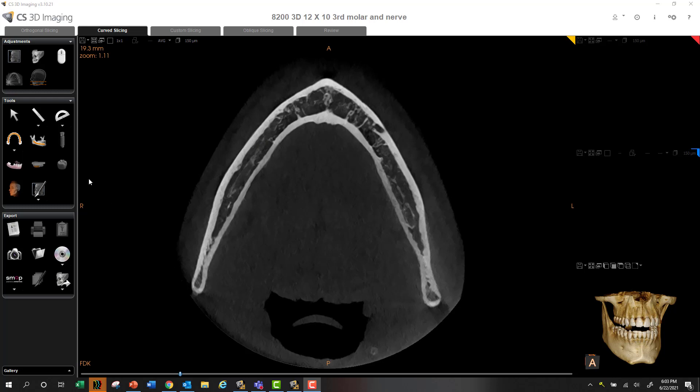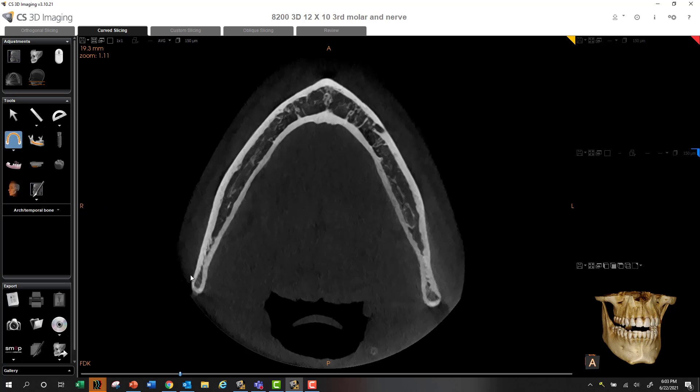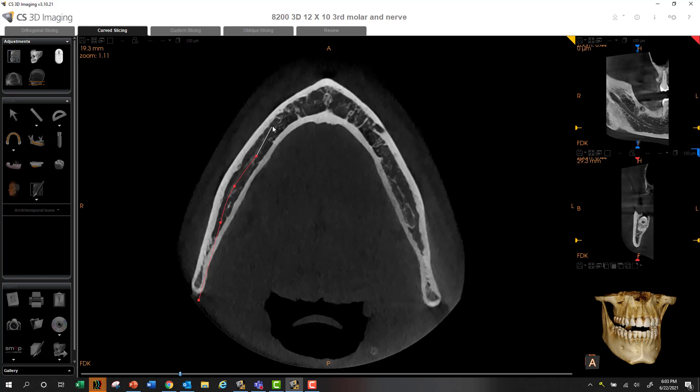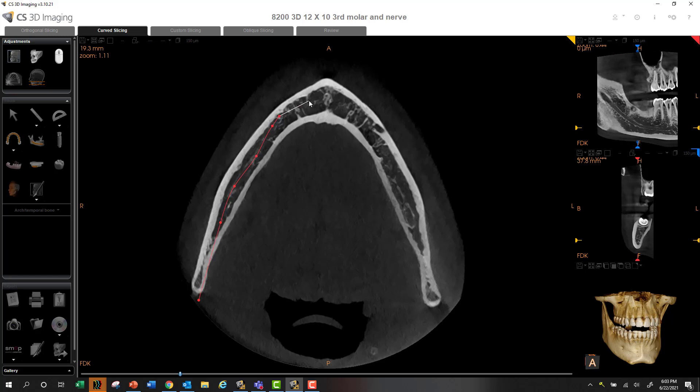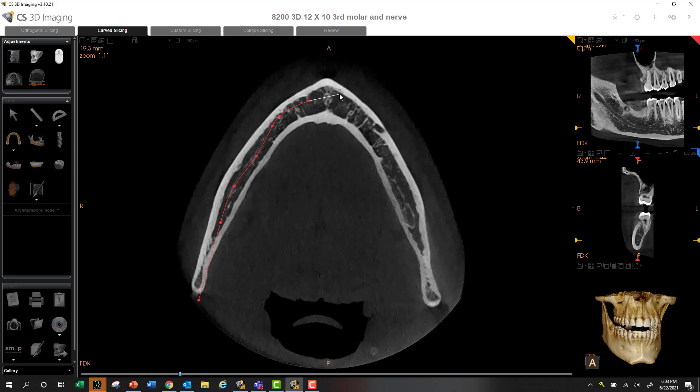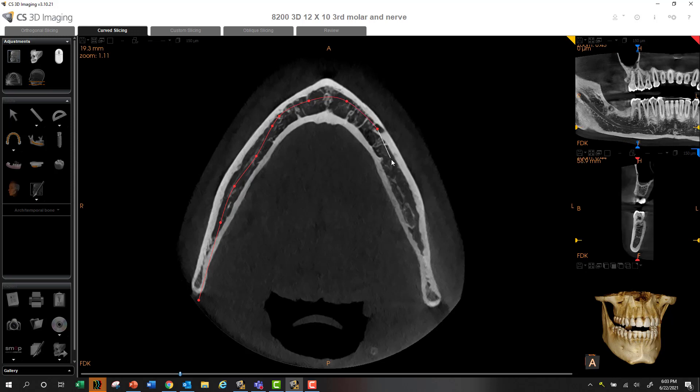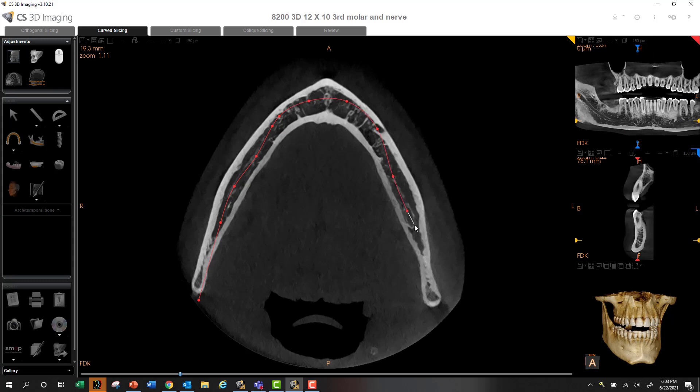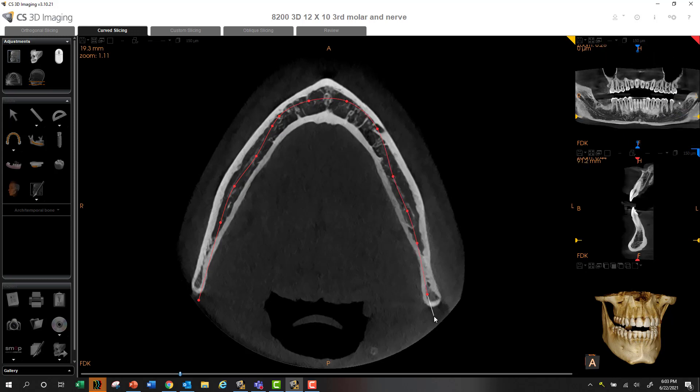So what we can do is map our arch and begin at the lingual aspect, begin clicking following the path the nerve is going. Go around the arch here, continue to go towards the buccal aspect here, and then follow the mandible down towards the lingual aspect and then double click.